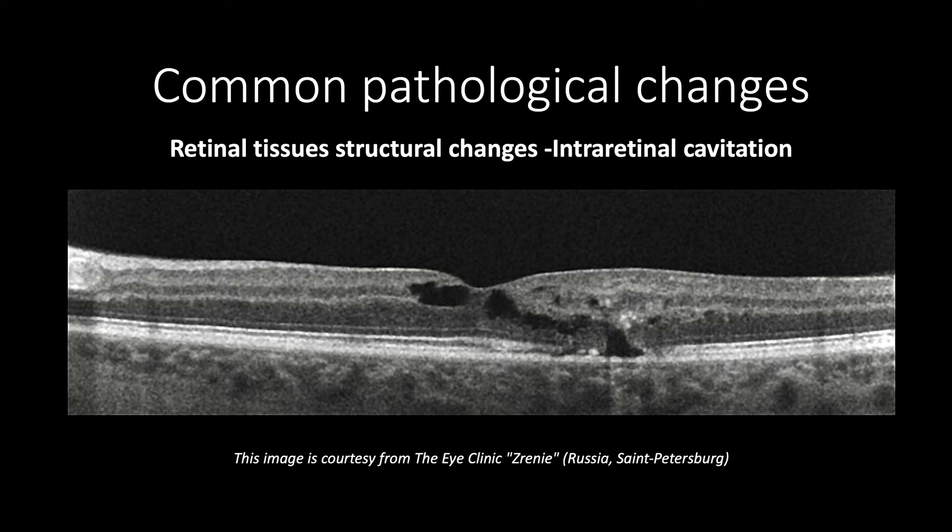This OCT cross-section shows intra-retinal cavitation with normal retinal thickness due to macular telangiectasia type 2.